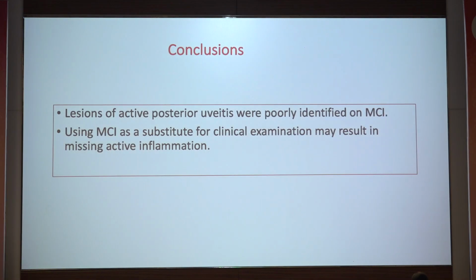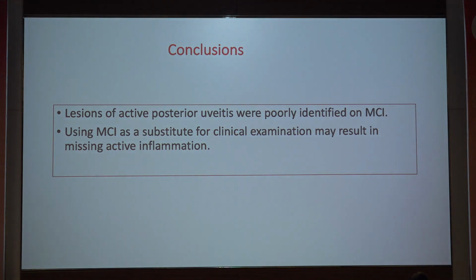So to conclude, these days we are relying a lot on color pictures, and many a time even in a WhatsApp group you see somebody posting a picture asking, what is the diagnosis? If you are posting only an MCI picture and not the true color picture, your experts may give you very different advice, and that could be a source of problems. So don't rely on this image alone. Rely on your clinical judgment. Thank you very much.